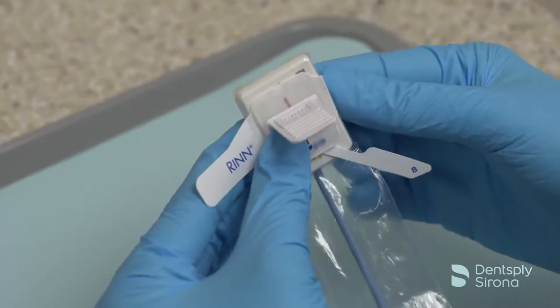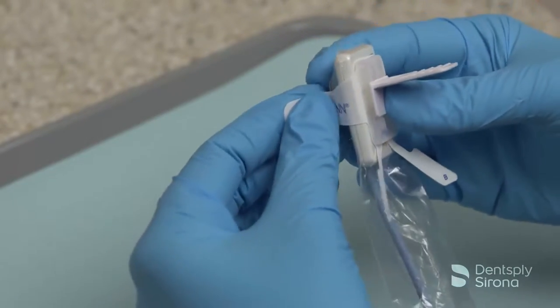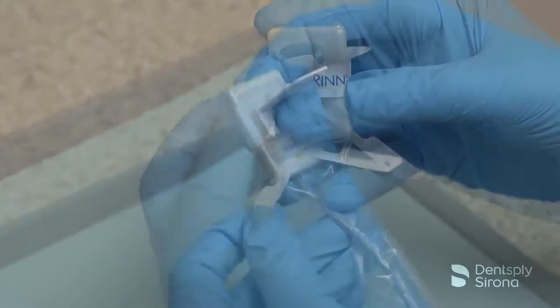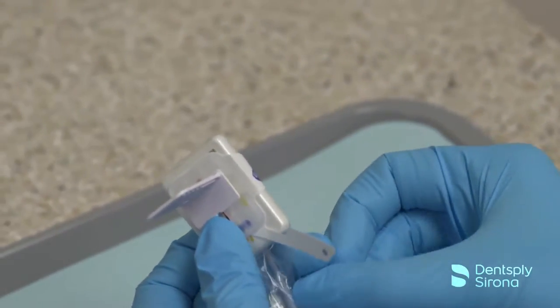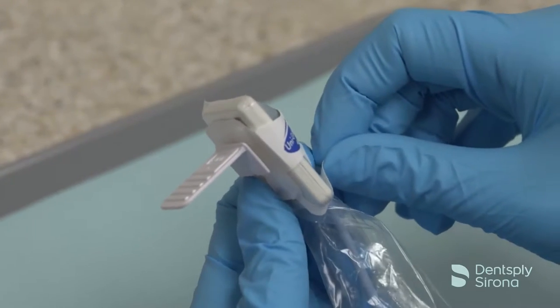Tightly wrap the arms around the sensor and barrier to keep it snug. Wrap the bottom tabs up and around the sensor and barrier. These tabs reduce the movement and potential misalignment of the sensor during use.